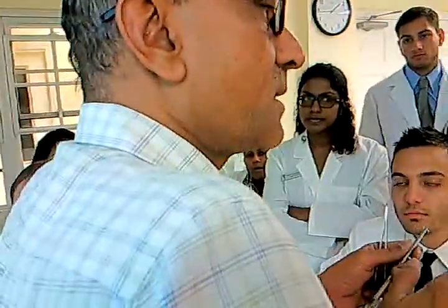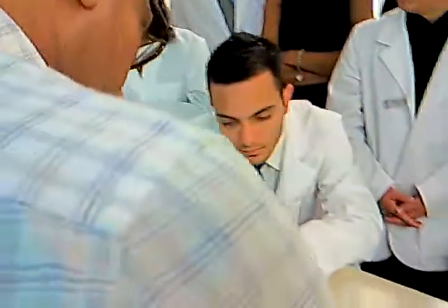This is used in places where the skin has got a subcutaneous muscle, like, for example, the neck. It's got platysma. Or the scrotal skin, which has got the dartos. What we want here is hemostasis as well as eversion of the edge. And that's how you'll notice when we do it, the edges will get everted. Because the underlying muscle in the subcutaneous tissue of the skin tends to invert the skin, and inversion is not good for healing. So we want eversion. So you will see that.